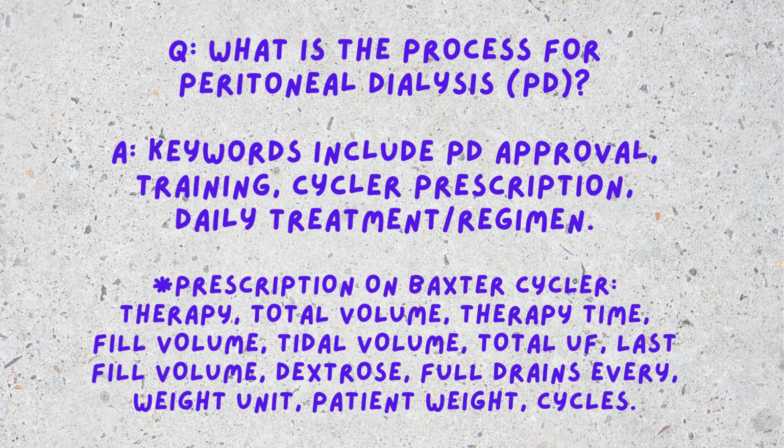By the time the training is done, your catheter should be ready for use, and then you would start putting fluid into your abdomen, into the peritoneum, excuse me, and then start to carry out peritoneal dialysis. So once that is settled and you're handling the fluid well, they will probably make an appointment to take out your tunnel catheter for hemodialysis, because you no longer need that as you are now solidly on peritoneal dialysis.